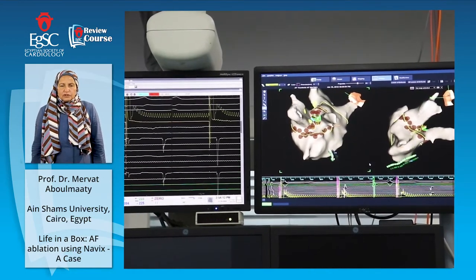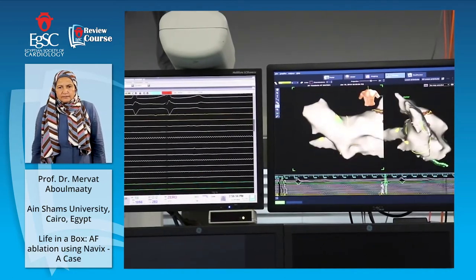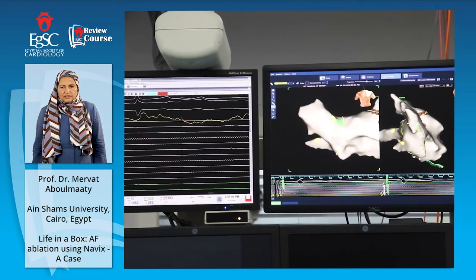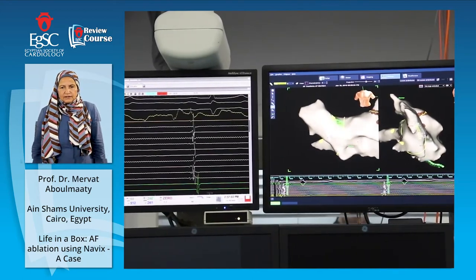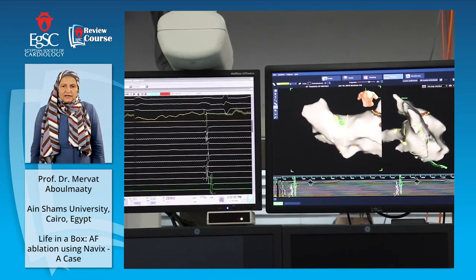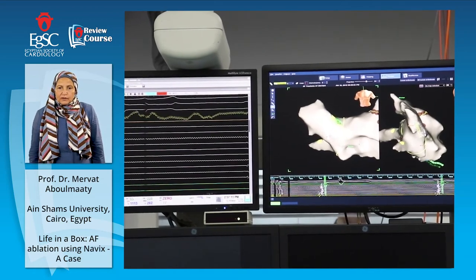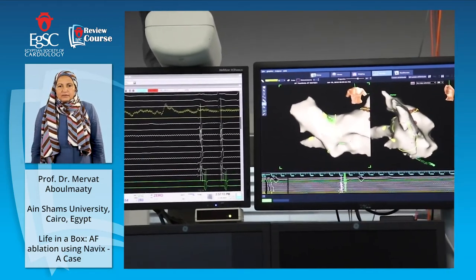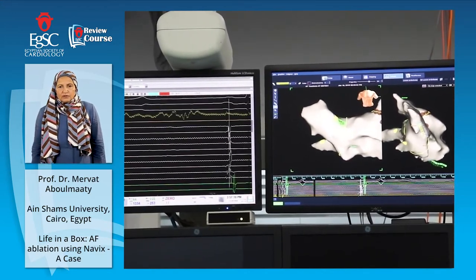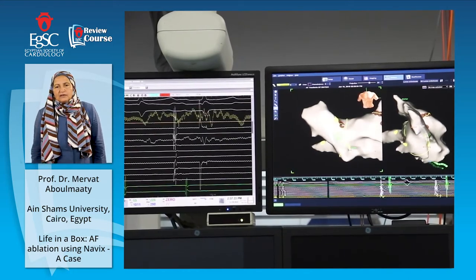Then I move to the right-sided veins. Yes, we'll move to the right-sided veins very slowly, gently. Now I'll go ablate the right-sided veins. I can move the Lasso, the circular catheter, to the right superior pulmonary vein. Here the green point is my ablation catheter, and we'll start ablating at this point, and we'll see the brown dot appearing here. This is the anteroposterior view.